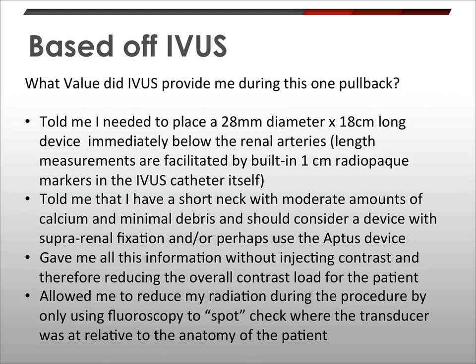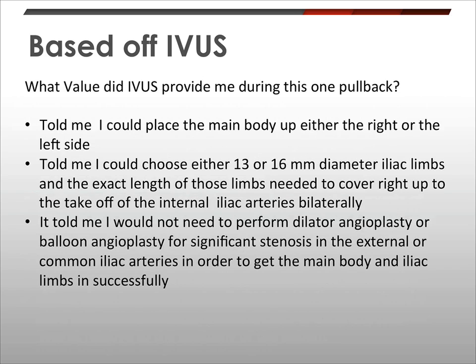Thus, before ever placing the device, I have a complete picture of what needs to be done, and I've used no dye and minimal fluoro time, which reduces the overall procedure time significantly. In the next slide regarding the iliacs, it told me that I could place the main body up either the right or the left external iliac artery.